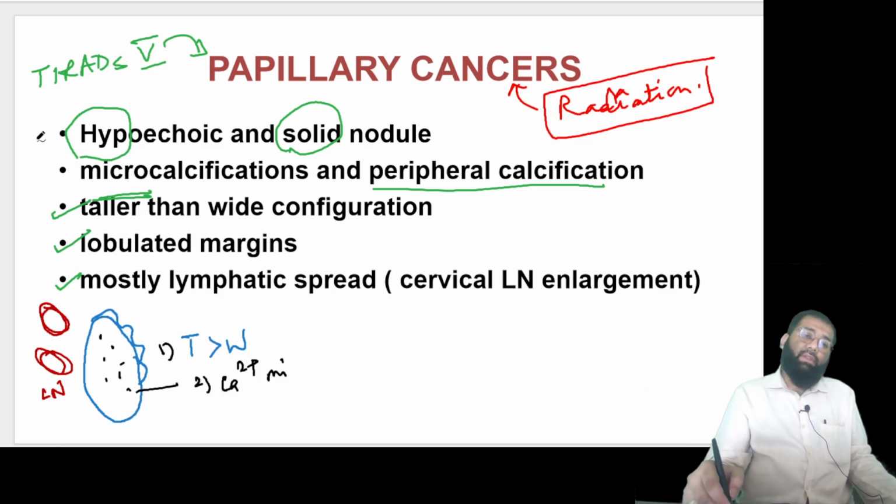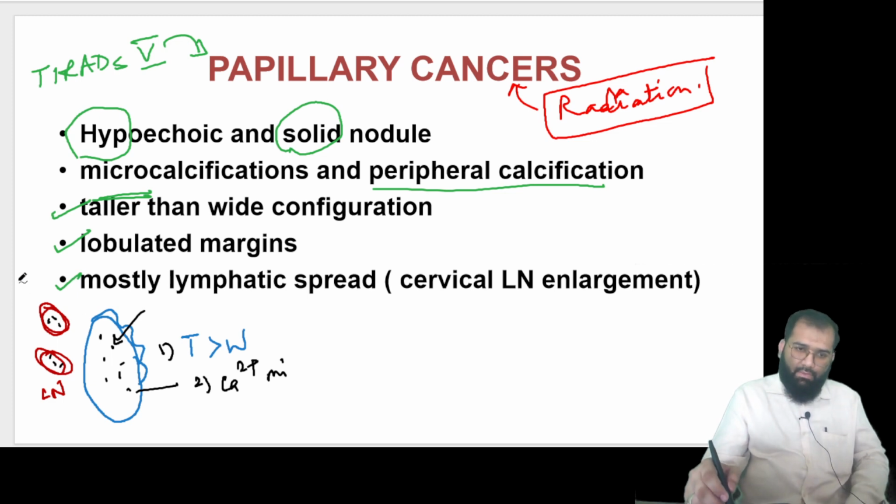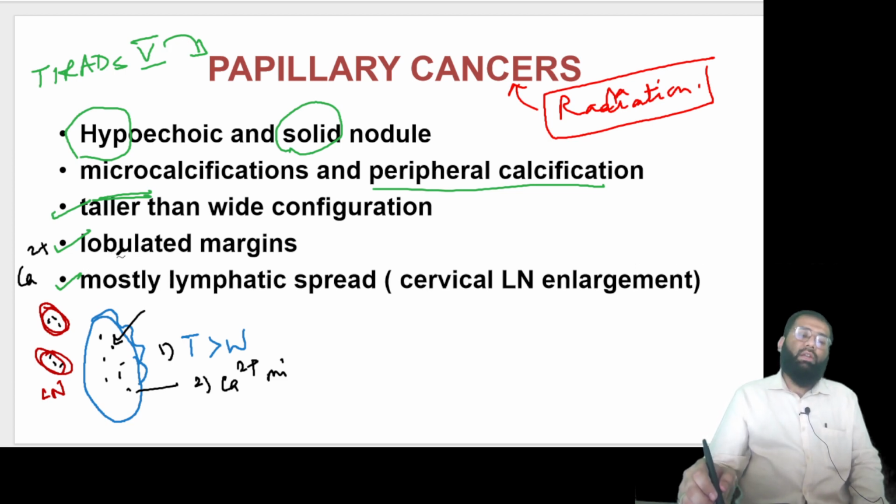So in order to differentiate this, a very important thing which you see in patients with papillary CA, the mets in papillary CA shows multiple calcific areas, multifocal calcification. So whenever you have multifocal calcification, that is a very, very important sign in a lymph node that this can be a met from papillary CA. So you should not get confused कि ये tuberculous node होगा.